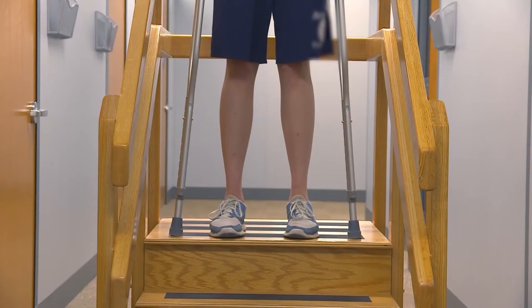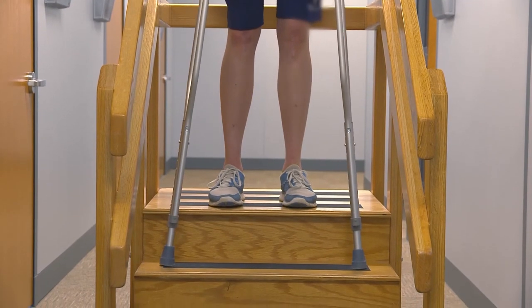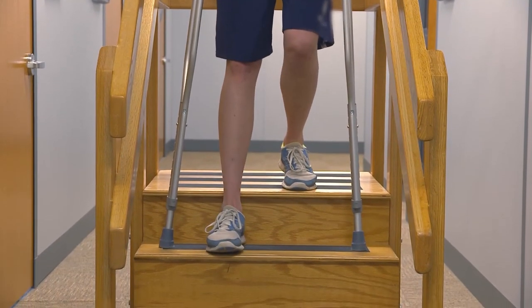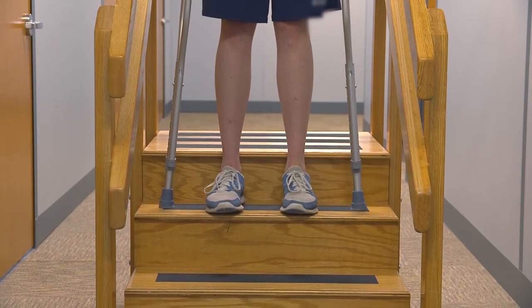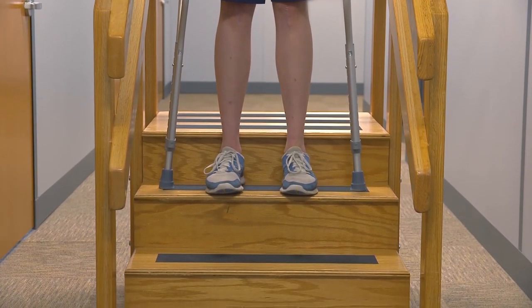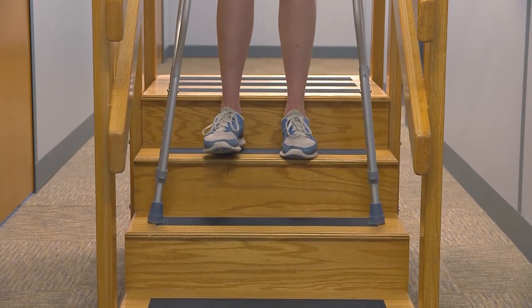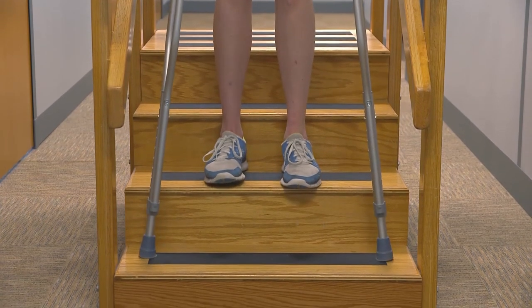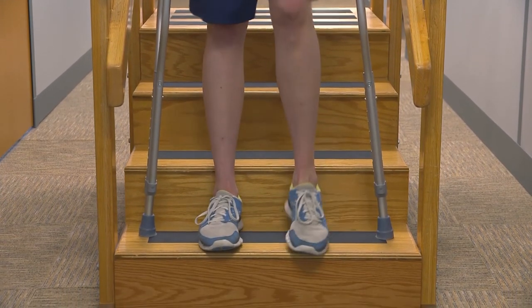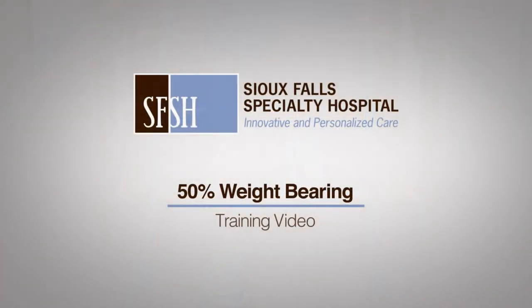When going down the stairs, place the crutches down on the next step. Step down with the surgical leg first by lowering down with the non-surgical leg, then step down with the non-surgical leg while maintaining your weight-bearing status. Make sure you have your balance and repeat the sequence: crutches, surgical leg, non-surgical leg. Remember the saying: down with the bad.